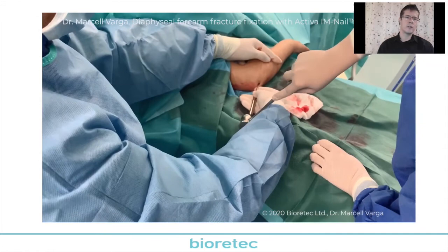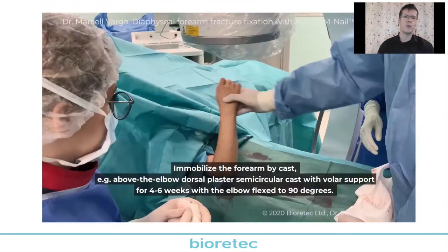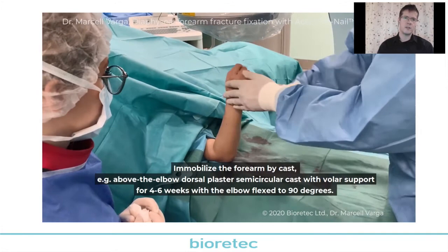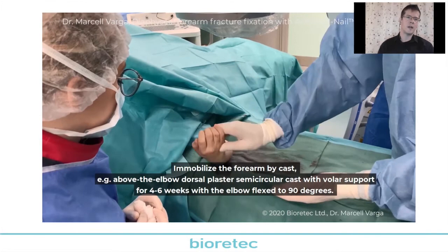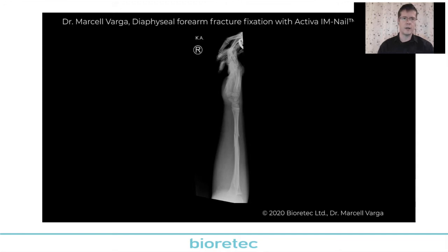And as we can see, this is the final picture. I made a stability test. It seems very stable, of course, and it seems very stable clinically, but I have to emphasize again, this kind of operation cannot be left without any cast, any immobilization. So we have to use some kind of immobilization. Momentarily, for the time being, the recommended immobilization is an above the elbow cast. Okay, let's move forward, please.